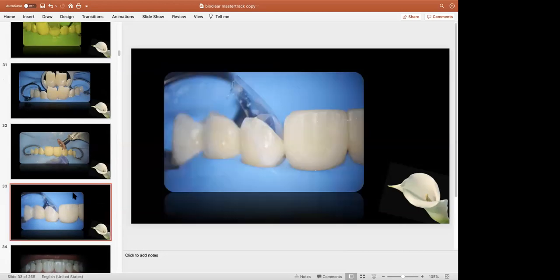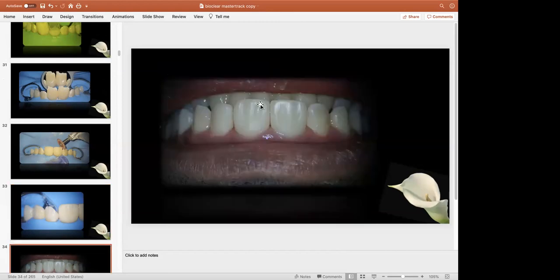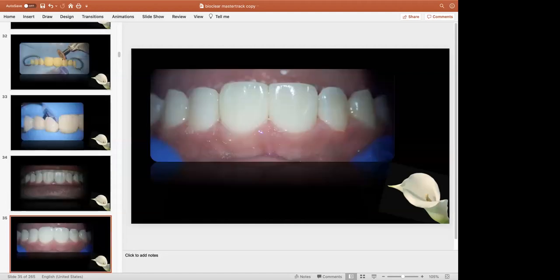Okay, so that was the prep size, and so x equals y. The x is the amount of tooth structure which I have lost. Then we did this. This was the picture after the finishing, but I've not completed the polishing yet. If you see, I've given a bit of specular highlights and a bit of grooves. That gives it a bit of natural structure, but we do not place grooves which will retain plaque. So we always have to take care that it's a non-plaque-retentive area.